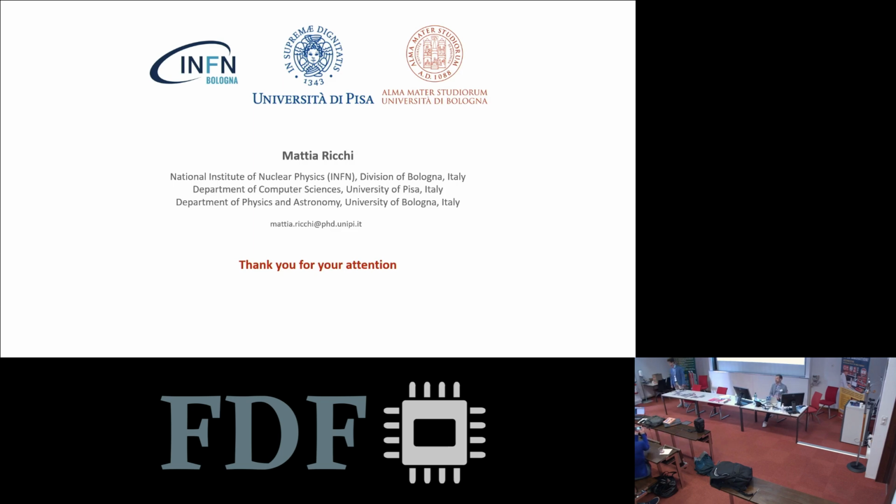Thank you for the great talk. My question is, what is the approximate bit width you are looking at here? Sorry, I didn't get the question. What's the bit width of the parameters you are looking at for this training on FPGA? Accumulator bit width for updating the weights. Oh, sorry, okay. So we have weights that are 8 bits, biases 32 bits, and all the other data 18 bits. How about gradients?